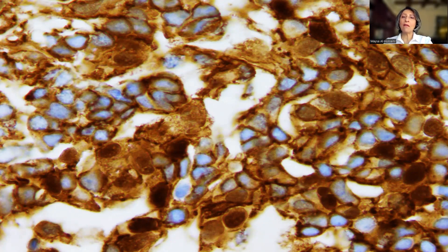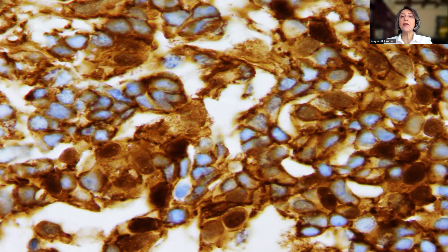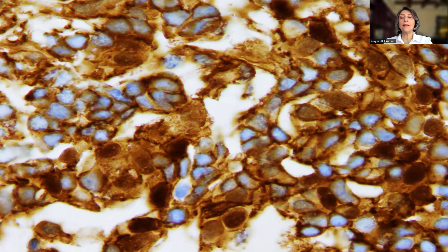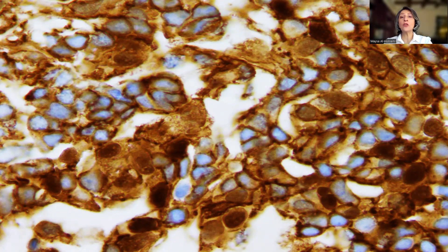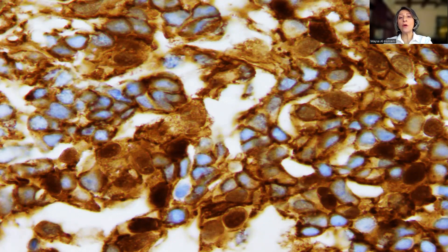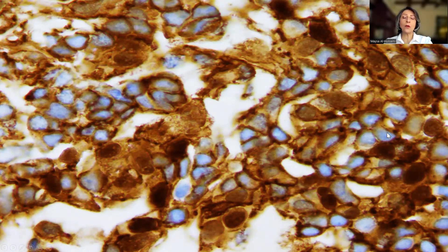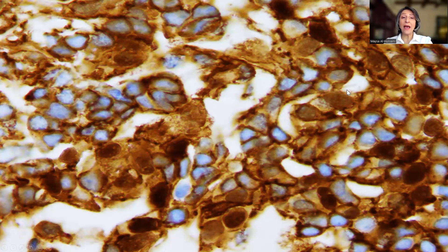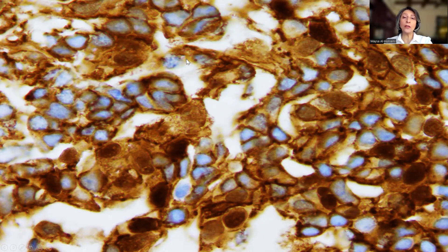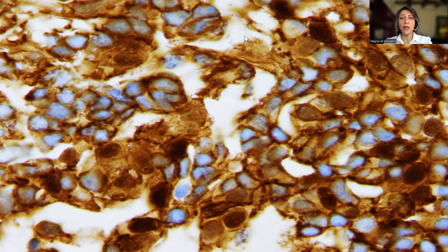Essentially, I think it's very helpful if you are in doubt about your beta-catenin to just put a drop of oil on the slide and then scan the slide on the oil immersion lens, which is the 100x lens. I think it will be of great help to you in your practice. I hope you find this tip useful in your daily practice. Thank you.